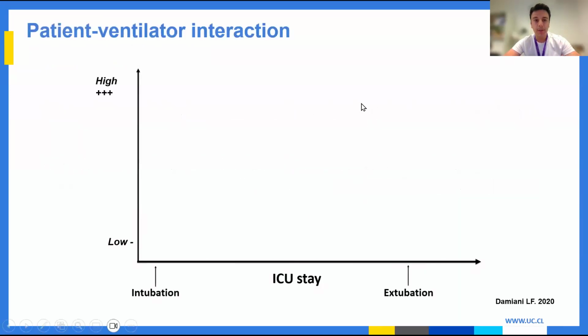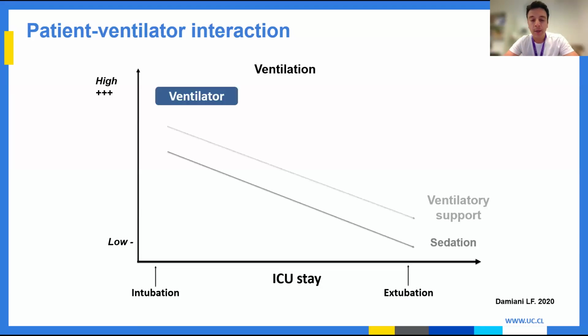Just to begin, let me remind you that when a patient is admitted to the ICU, in the very acute phase of ventilation, we have a patient with high ventilatory support and high sedation, and the ventilator controls most of the ventilation. But as soon as the patient evolves and gets better, we start decreasing ventilatory support and sedation so that the patient starts awakening.